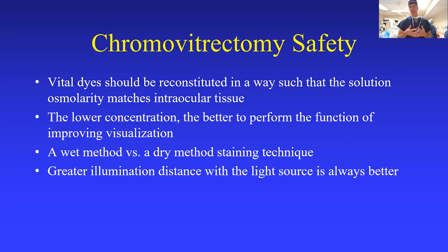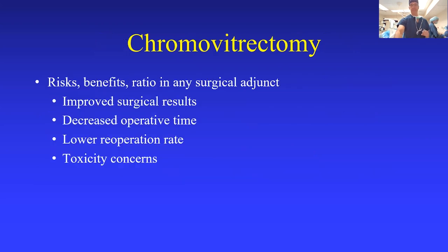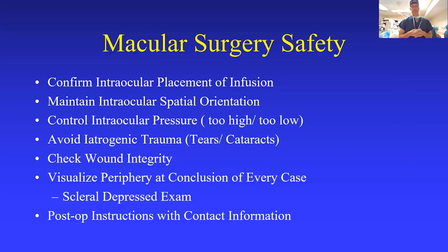Wet versus dry methods. Be careful in dry method staining if you're drying the eye out first internally by doing an air fluid exchange and putting the dye directly on the macula, though you may get a better stain, you're also exposing the retina to more possible toxicity. So the benefits are improved surgical results, decreased operative time, lower reoperation rate, but the only downside is really toxicity concerns. So be careful with chromovitrectomy.